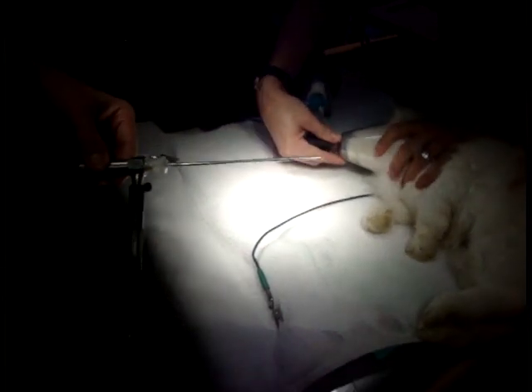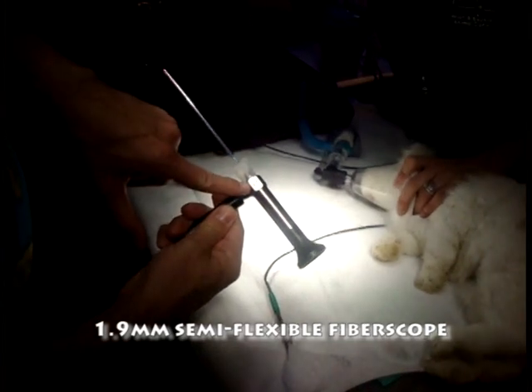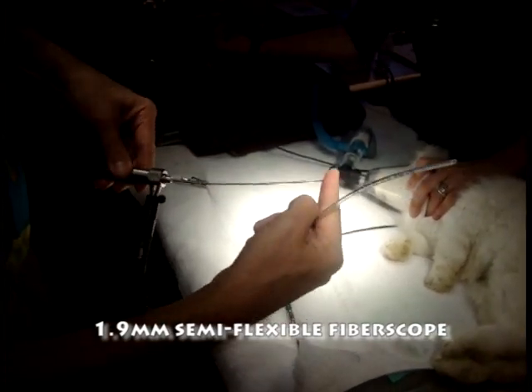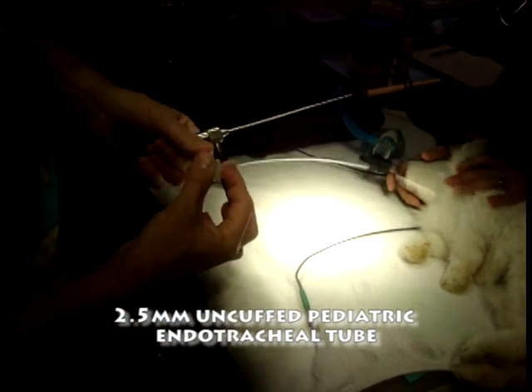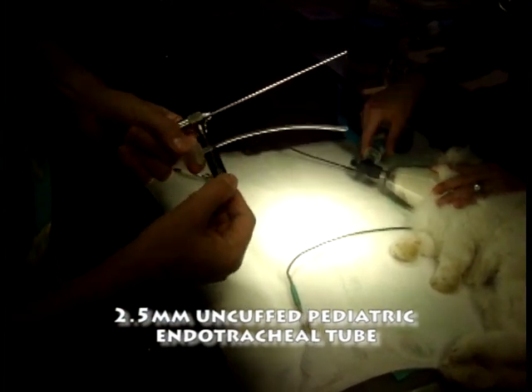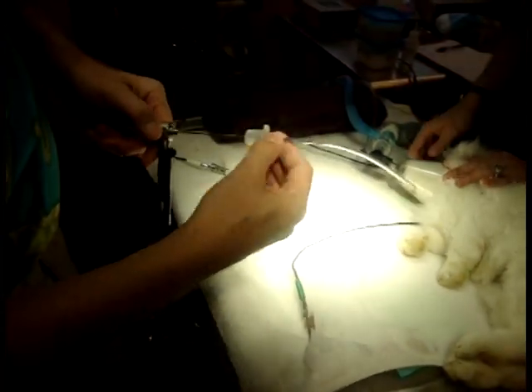Today I'm going to intubate a rabbit with MDS's 1.9 millimeter semi-flexible endoscope, also known as the focus scope. We're going to intubate using a non-cuffed Murphy eye tube, or a pediatric nasal tube. The brand I'm using is SunMed, also available through MDS.